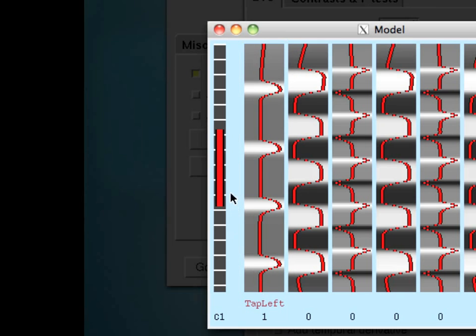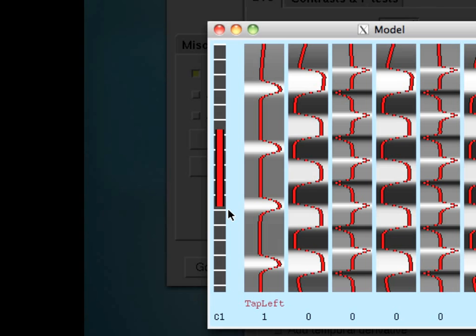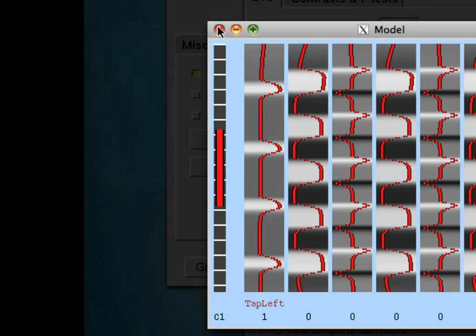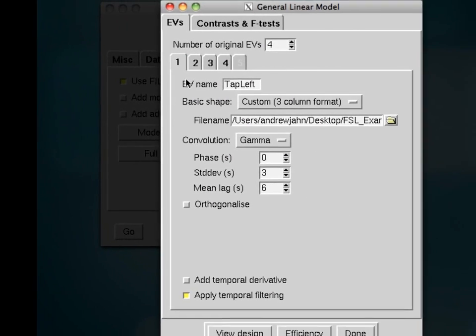Lastly, this red line over here, this represents the size of your high pass filter. So this represents an interval of 100 seconds. Now, if any of these whiter shaded regions were greater than the length of this, then that means that they lasted greater than 100 seconds. And therefore, they might be filtered out by the high pass filter.